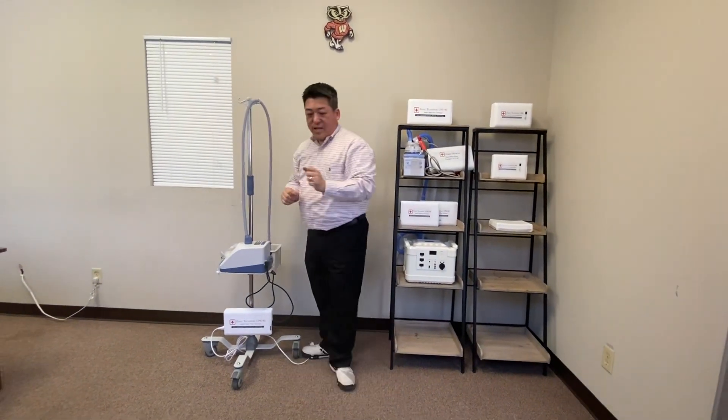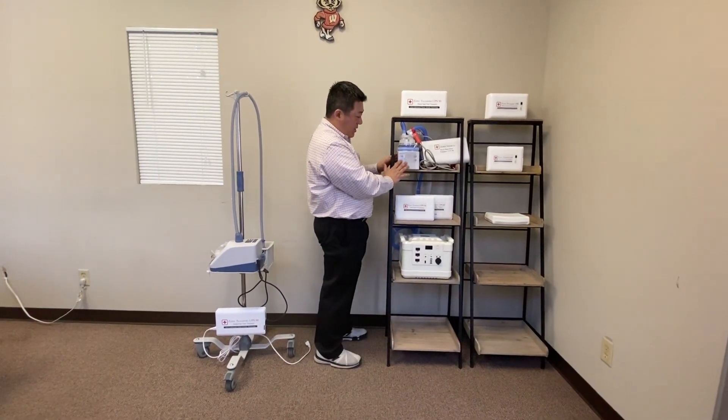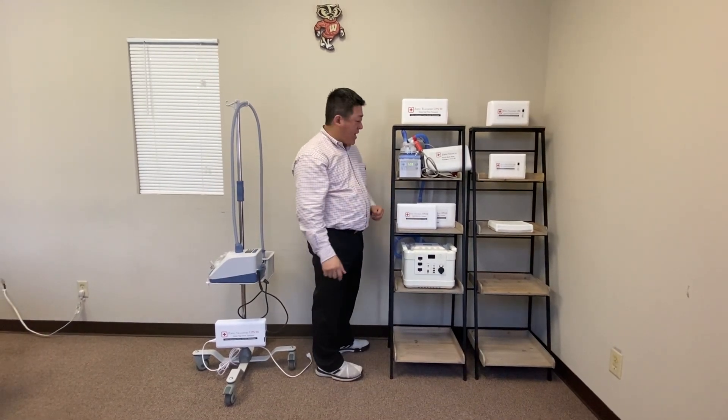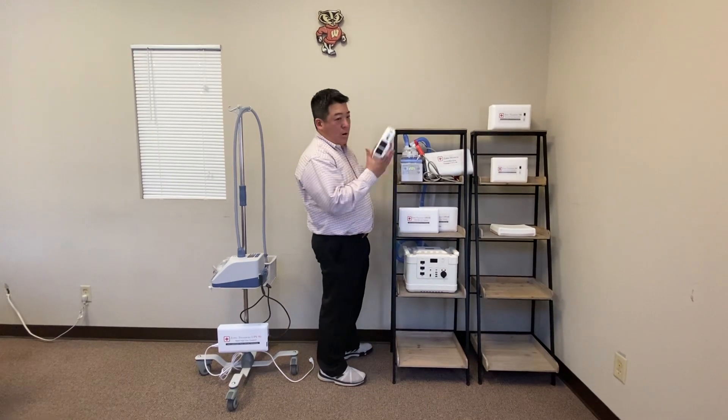For the UPS 90, we also have a heater version. Here we have an F&P 850. You simply press start. It runs 90 minutes at 37 degrees Celsius. Now, you can transport for so long.